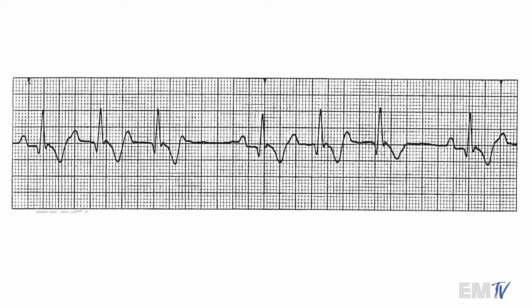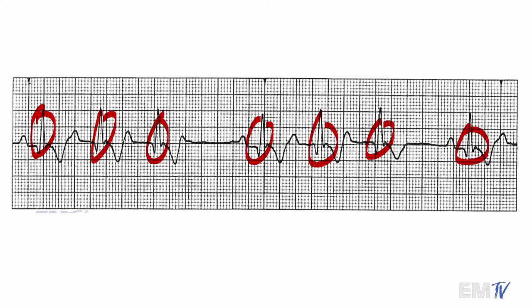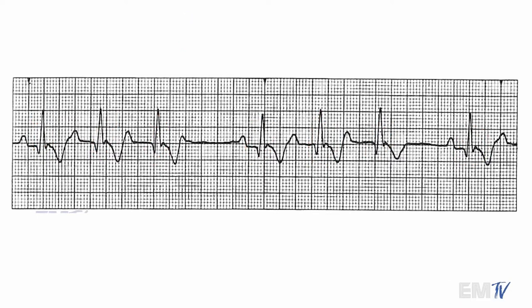Let's go ahead and count out our QRS complexes here first: one, two, three, four, five, six, seven. So it's not bradycardic — it's a heart rate of 70. But let's go ahead and examine a couple of things here. There are some areas where there are P waves and no QRS complexes. Well, specifically there's one area. That's what makes this card a little bit more challenging.